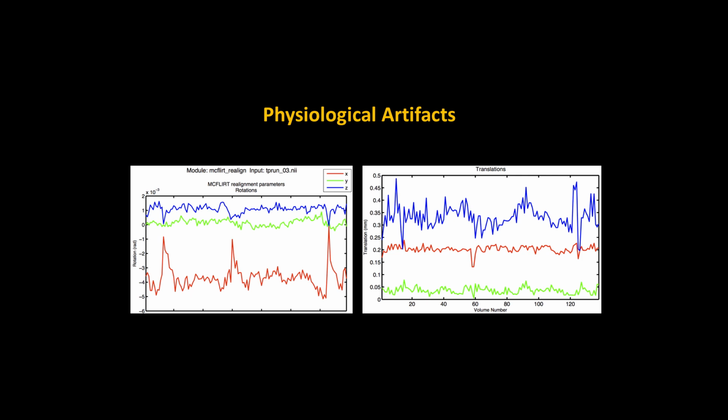On the left here, this is called a motion parameter chart, probably familiar to most of you. One thing I want to point out is the scale of these charts. So it may look at first glance that there's a lot of motion going on, but the scale is times 10 to the negative third, so this subject actually hardly moved at all. It's a pretty good subject.